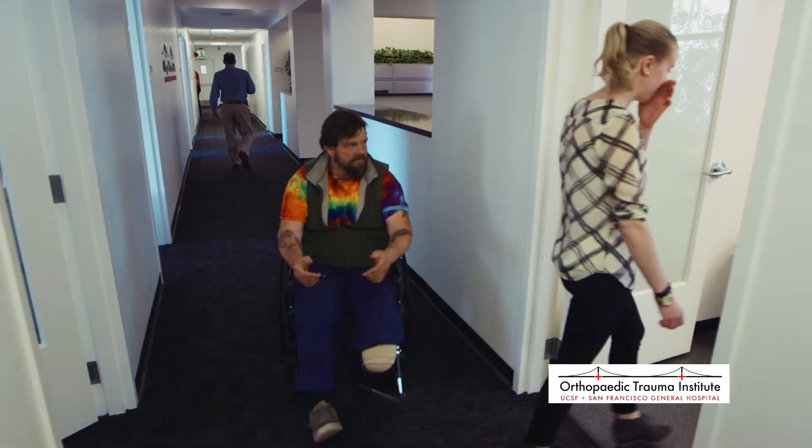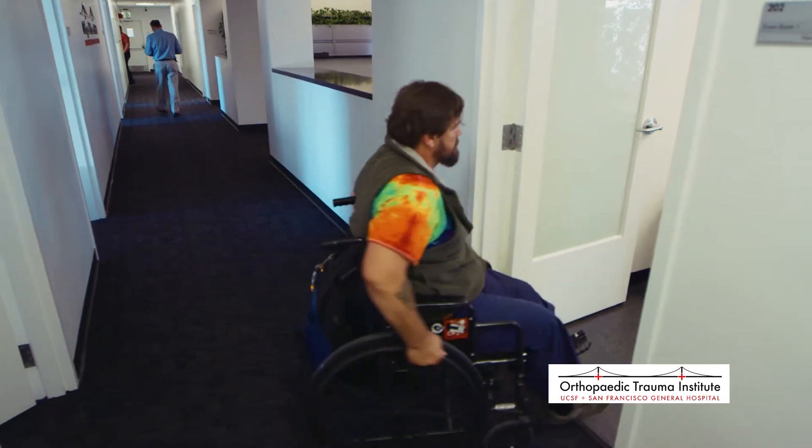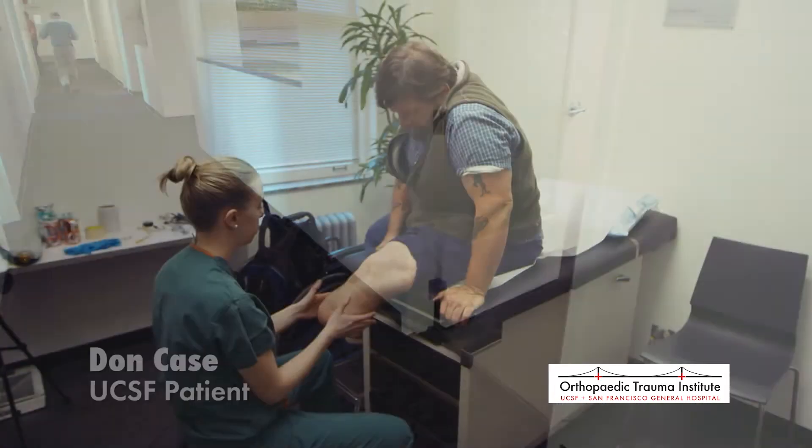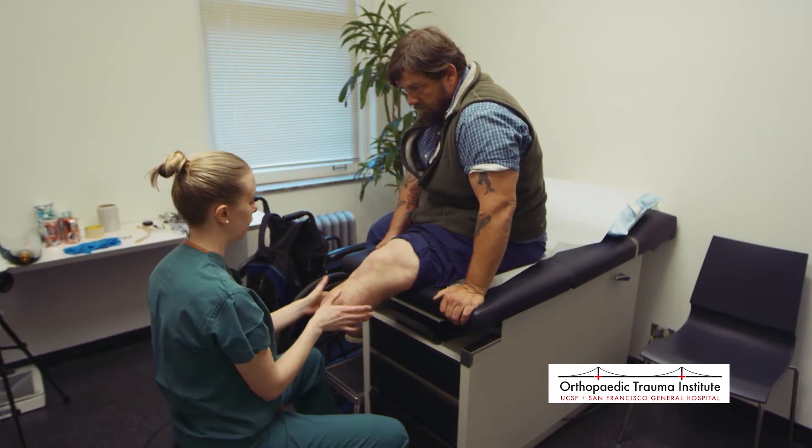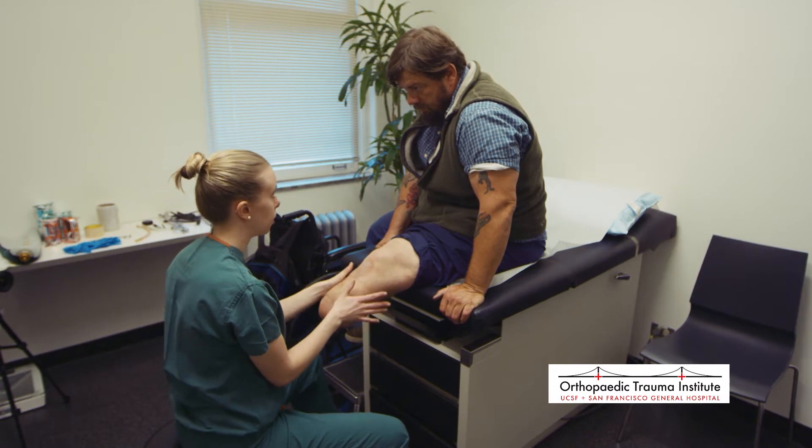Over the past several months, Hannah has been working with Don, a patient at UCSF's SFGH Orthopedic Trauma Institute. During these appointments, she begins to undertake the process of creating his new prosthetic limb.